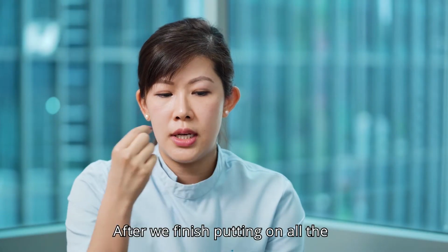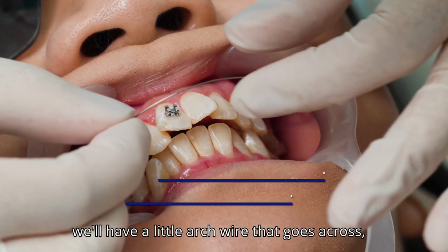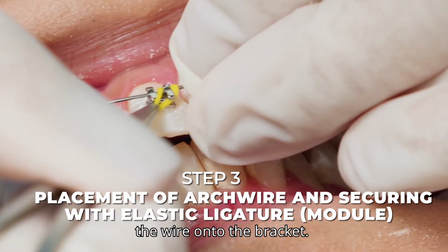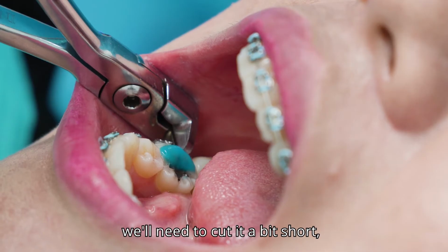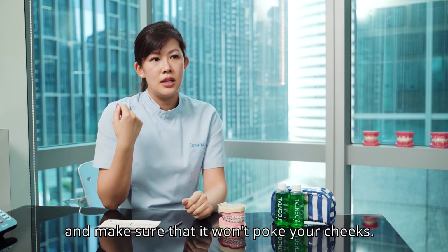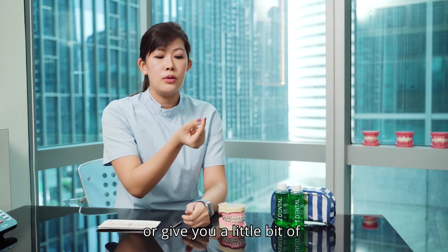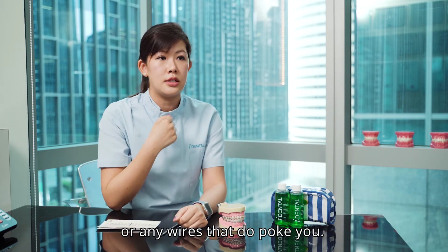After we finish putting on all the brackets on your teeth, we'll have a little arch wire that goes across, and a little module to hold the wire onto the bracket, okay? At the ends where the wire sometimes pokes out, we'll need to cut it a bit short, cinch it back a little bit, and make sure that it won't poke your cheeks. If it does hurt you, just feel free to come in, we'll cut it off a little bit, or give you a little bit of ortho wax to put onto your brackets or any wires that do poke you.